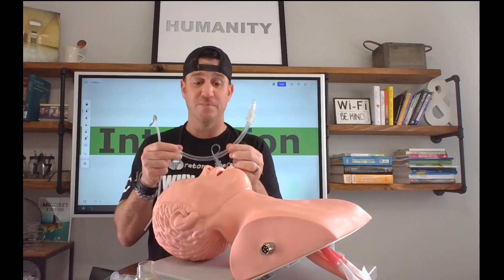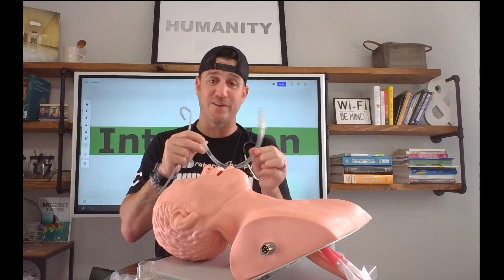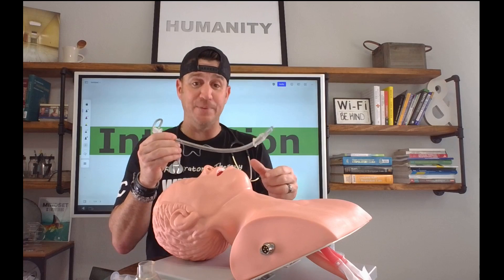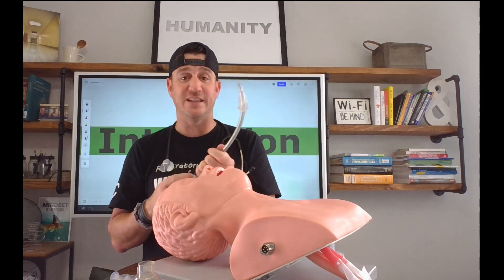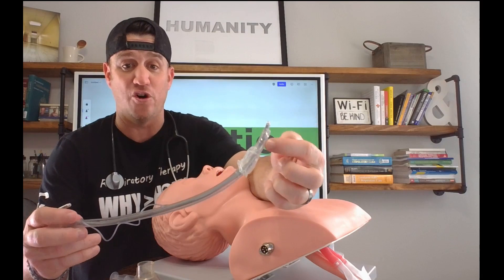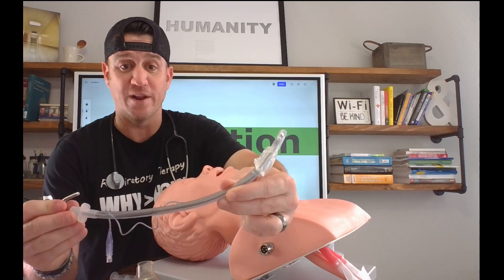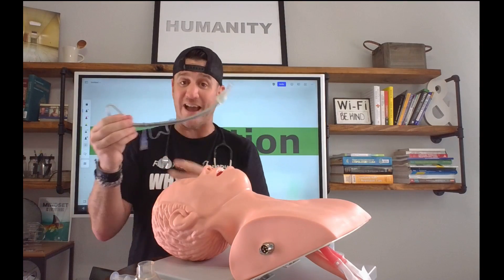To insert the endotracheal tube when performing an oral intubation — this is not a nasal intubation, this is an oral intubation — I realize that this tube is very bendy, so I want it to be rigid. That's why I'm going to utilize a stylet. The stylet is going to increase the rigidity of the endotracheal tube so that I can control the tip with the proximal end. Now, key point: anytime you use a stylet, you don't want the tip of the stylet to protrude out past the tip of the endotracheal tube. You see that hole right there — that's called a Murphy's eye. You want your stylet to be proximal to the Murphy's eye. That is too far. We want it back just before the Murphy's eye and we want it to stay right there. I can put a slight bend in my stylet so it can't advance anymore, and now I have my endotracheal tube and stylet ready for intubation.